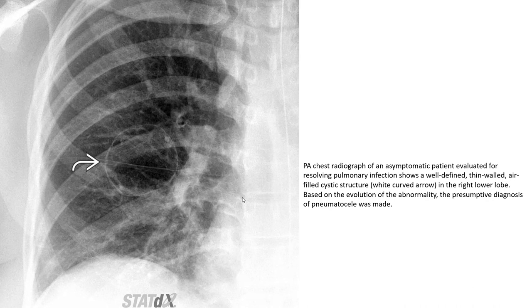The thin-walled cystic structure with a well-defined thin-walled air-filled cystic appearance is seen in the right lower lobe. Based on the evolution of the abnormality, the presumptive diagnosis of pneumatocele was made.